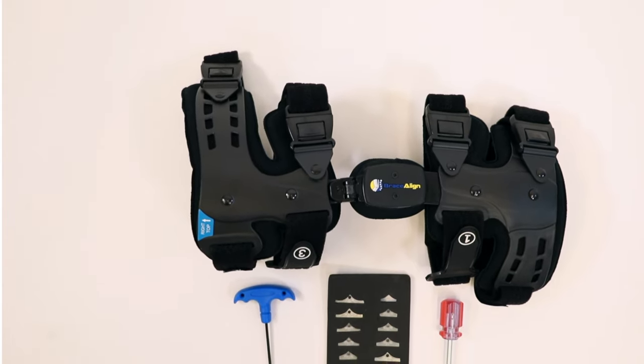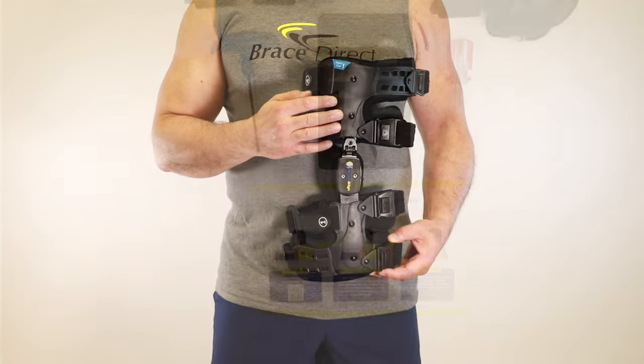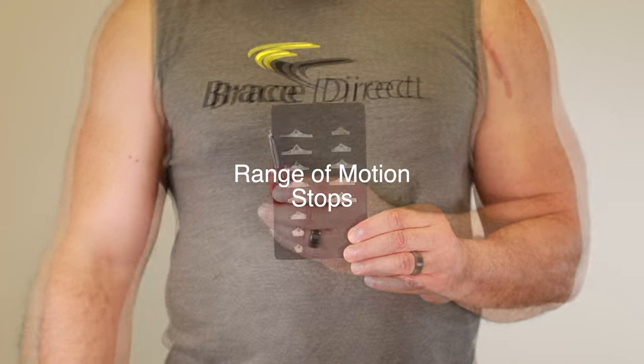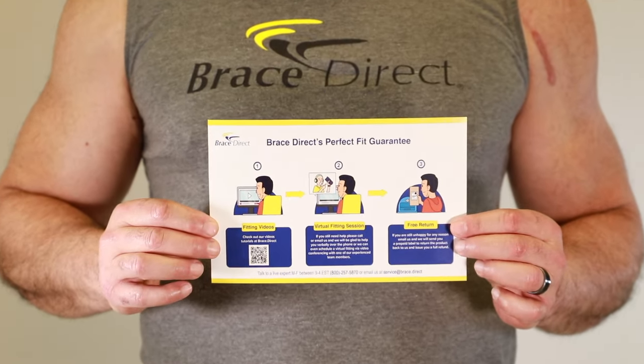Thank you for purchasing BraceDirect's OA Unloader Knee Brace. Every Unloader Knee Brace bag comes with the following: the Unloader Knee Brace, Varus Valgus Adjustment Tool, Range of Motion Stops, Phillips Head Screwdriver, and our BraceDirect Perfect Fit Guarantee.